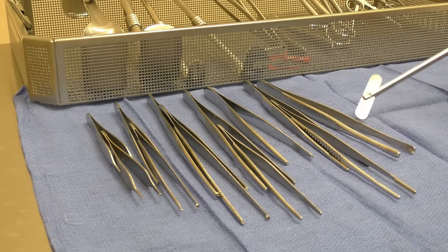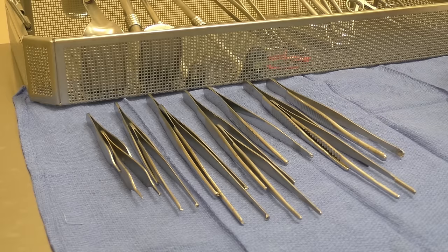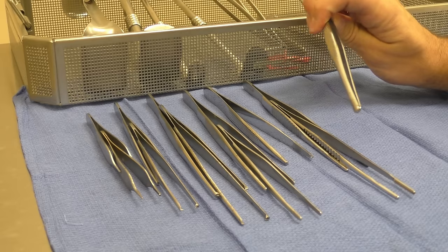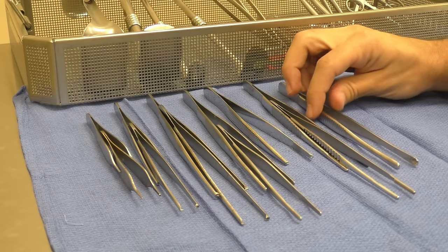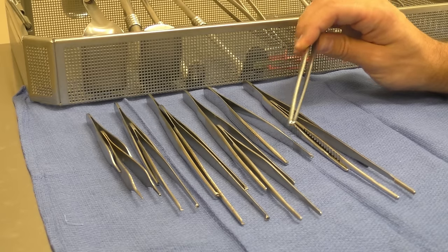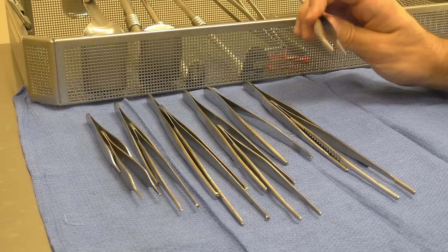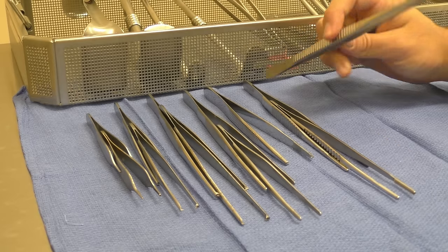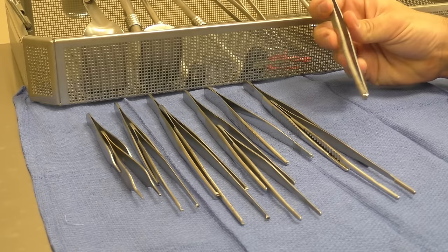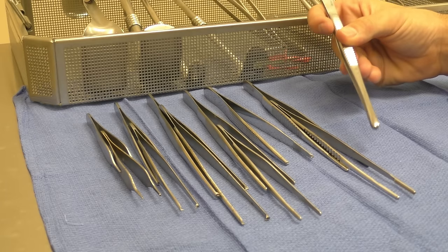And which leaves our Russian forcep at the end. It has this signature round tip, and this is good at grabbing stuff as well. I've seen surgeons pack wounds with dressings with the Russian, but it's also good as a general use item to if they need to scoop out a lot of tissue and grab a lot of tissue for specimen or something like that.